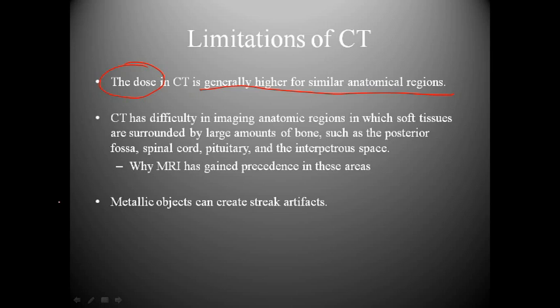But the ultimate question and the ultimate thing to ponder is, are the benefits that we gain from CT enough to not disregard, but allow us to justifiably utilize CT? We cannot disregard the dosage or some of the difficulties that CT has in processing images, but is it justifiable? And that is the question of the day, and probably the question for many years to come, as we see CT still growing in prevalence. What is the ultimate outcome?